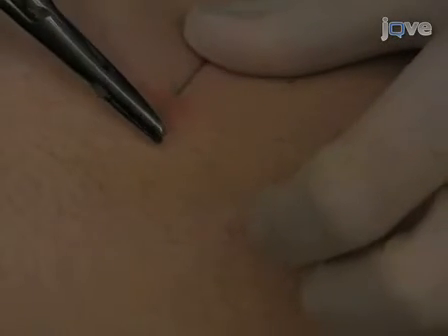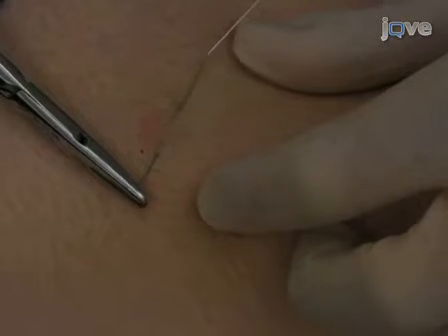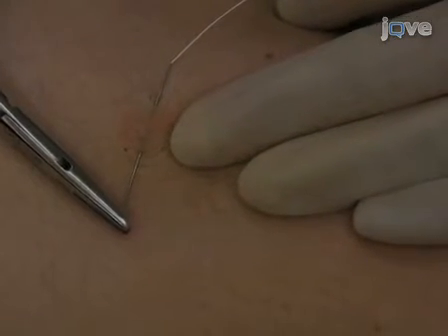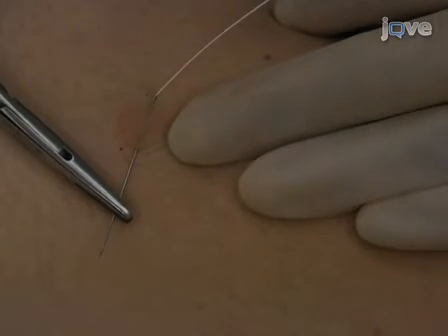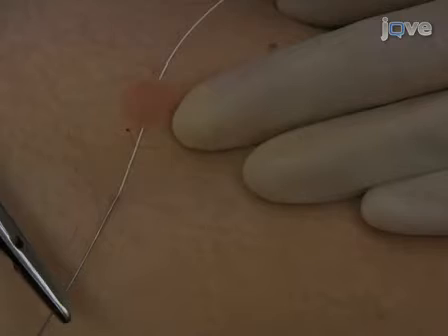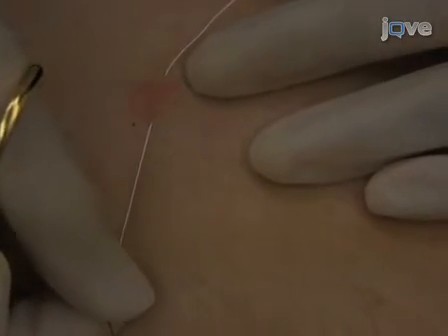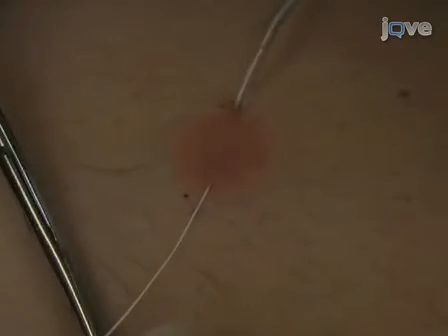Once the needle has been pushed through the exit point of the skin, pull gently on the needle to feed the attached catheter through the skin. Gentle handling is critical because the catheters are small diameter and very fragile. Pull the catheter until it is completely threaded through the skin. That is, the base of the larger plastic tubing embedding the distal end of the catheter should touch the skin at the entry point. Again, little to no bleeding should occur, indicating that the catheter has been placed correctly.